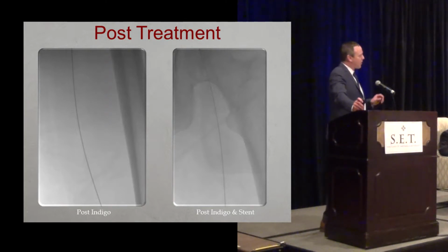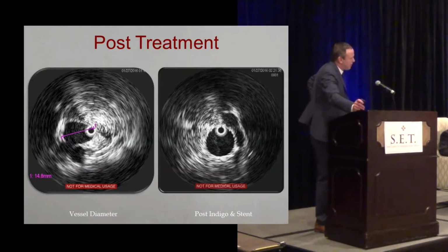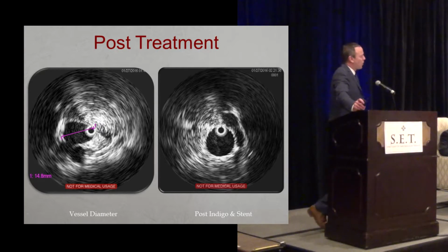Now, having been in the thrombectomy space for quite some time, I'm never convinced that I actually remove all the clot. And sometimes I feel like maybe I just made a channel through the clot. So I typically will utilize IVUS. Here you'll get a feel for what we removed. There you can see the stents coming through the iliofemoral segment. As we come into the femoral vein, that's probably right at the groin, you can see there's still a little bit of clot behind the stent, but that's probably more chronic.